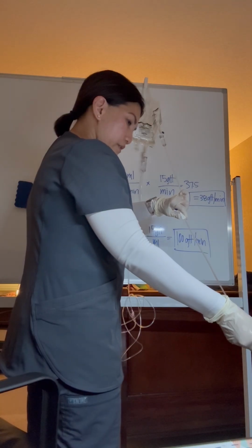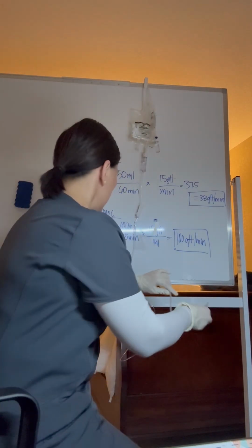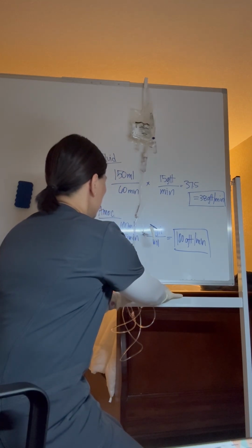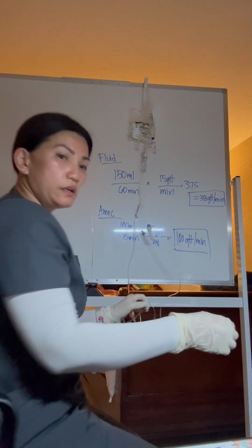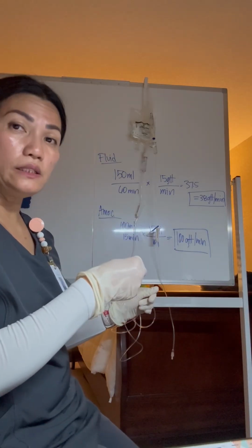All right, so now that it's set, we're going to go ahead and close it. We're going to take our alcohol swab and we're going to clean the white port.